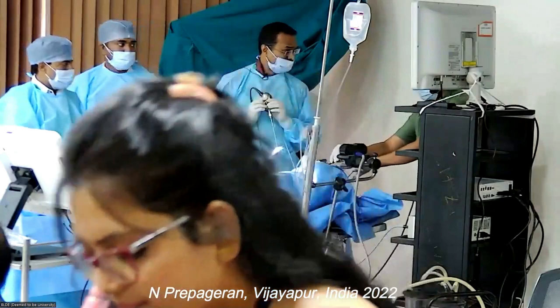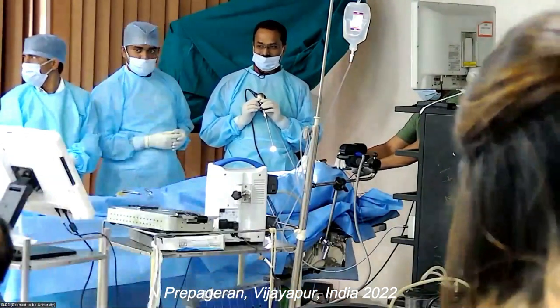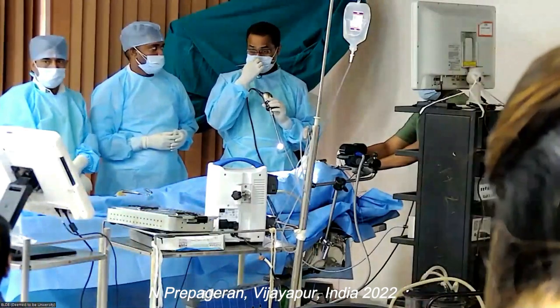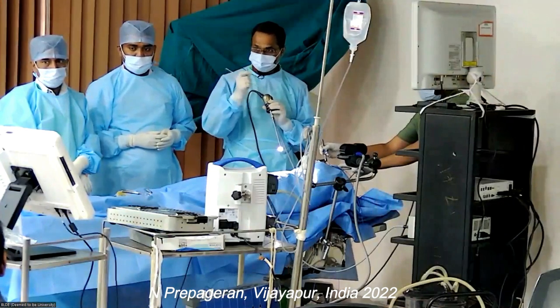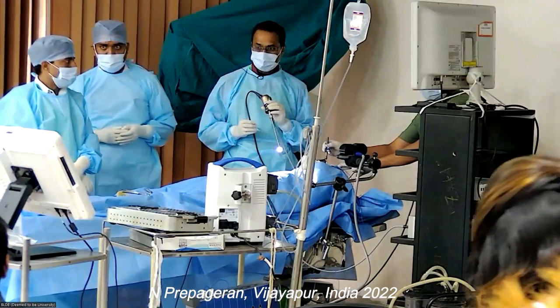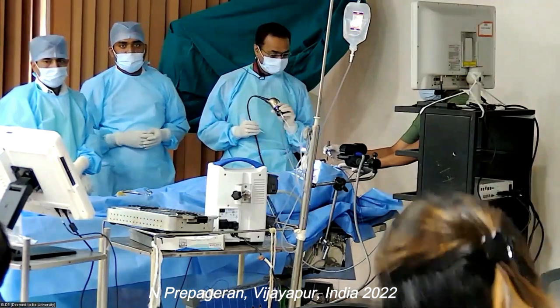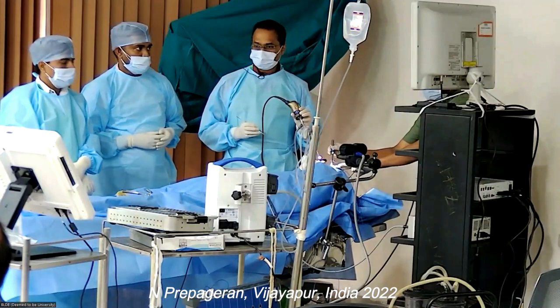Are you all done? Okay, I'll wait for you. Medtronic is doing the IGS. Because it's not fresh frozen, it's a little bit more difficult to register because the skin is a bit harder, it's soft embalming. As I mentioned before, they've already used it for rhinoplasty.